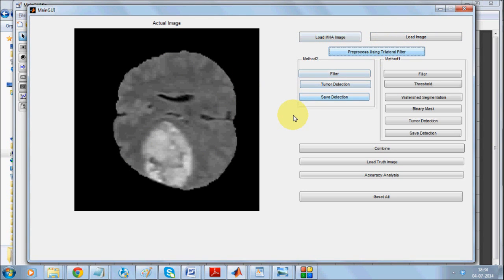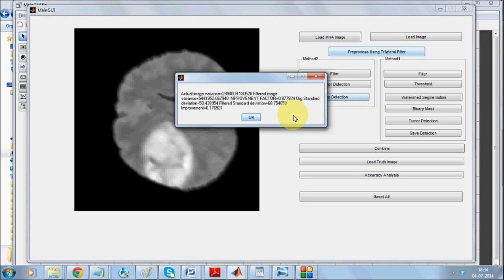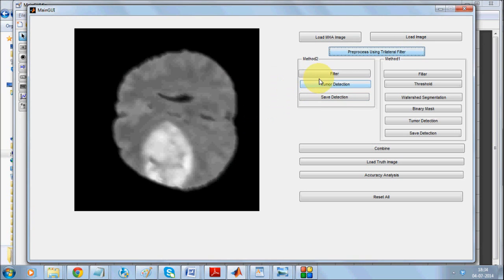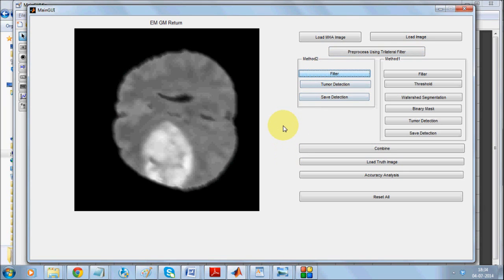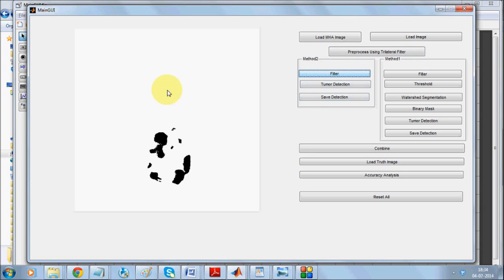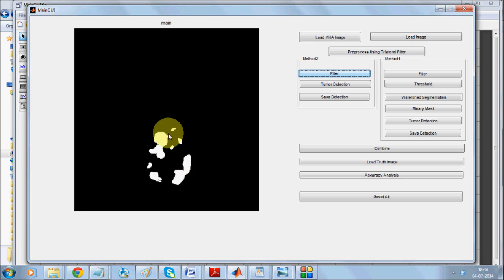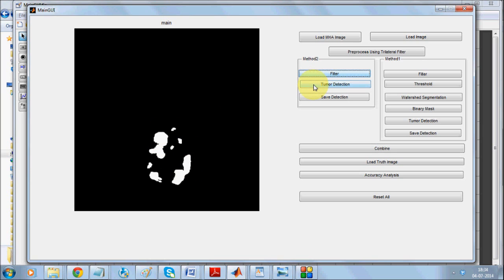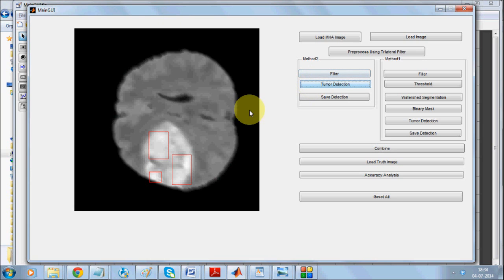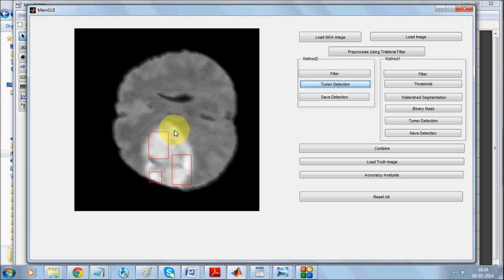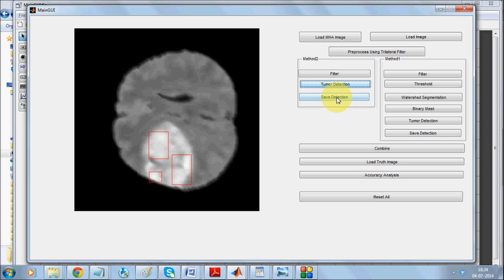Now if we go for EM-based segmentation it detects this region. As you can see it has not been able to detect the whole region, only part of it, and this is where the tumor is showing. You see, this algorithm cannot detect this entire area. It depends upon the intensity values. However, we will be saving the value.